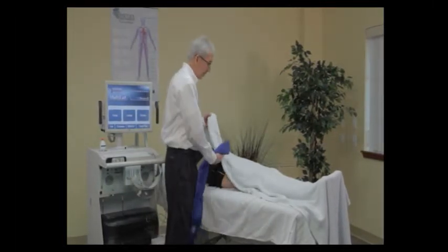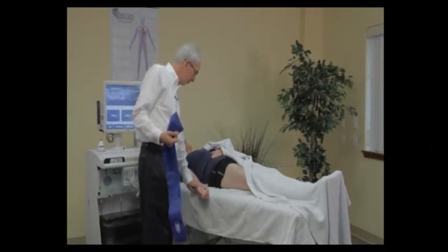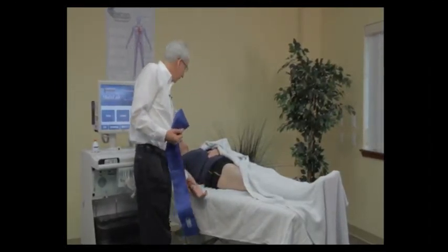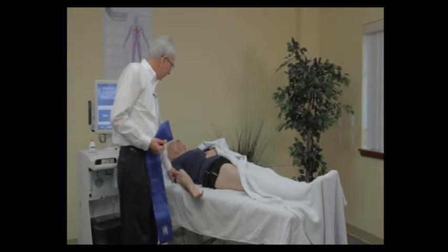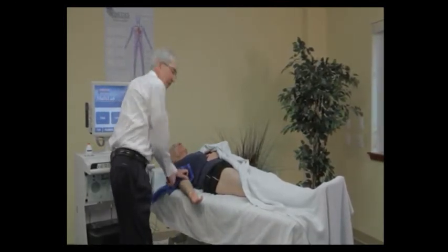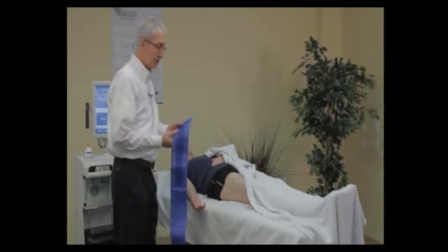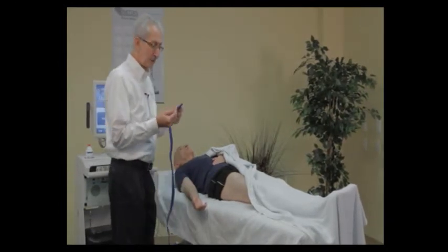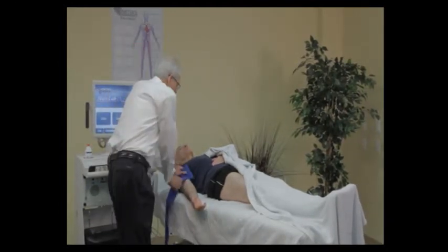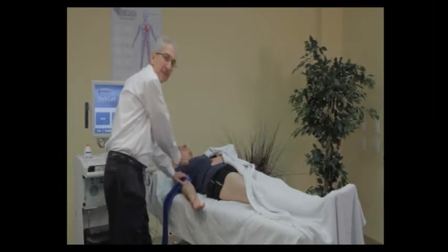I'm going to talk about arm cuff placement. You want the patient's hand to be open with the palm forward. Think about the area where the brachial artery is — make sure you place the cuff high up enough so you have easy access to the crease in the arm. Also make sure the inlet hose for the tube on the cuff is not protruding into the area where we're going to be looking with our Doppler probe to find that brachial artery.